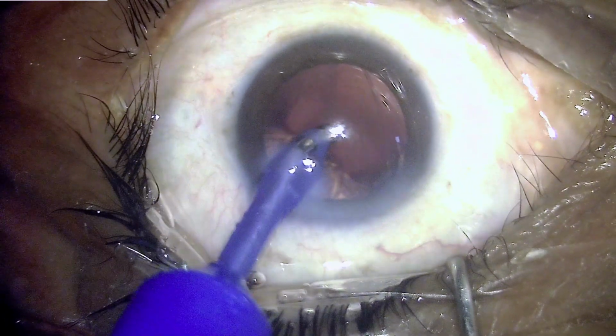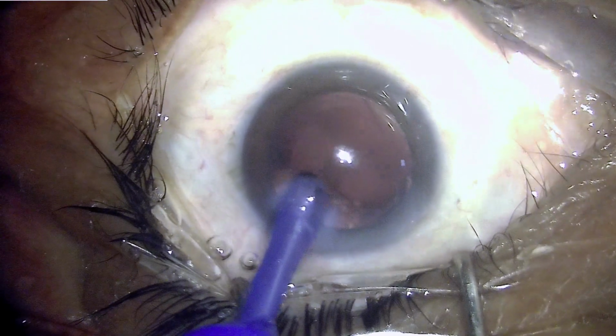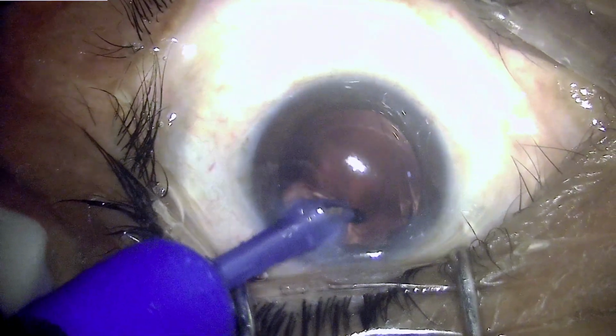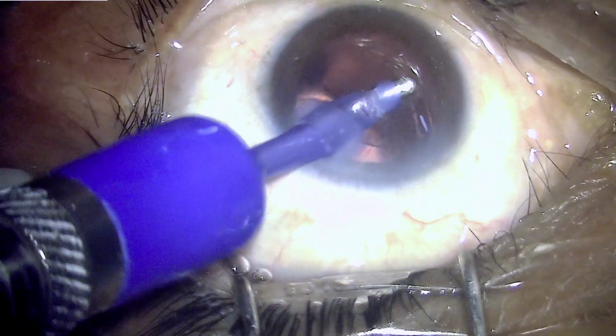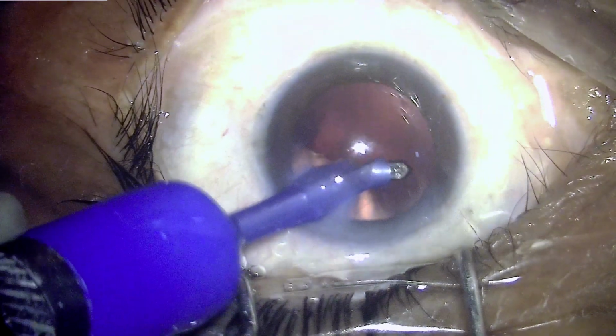So in a nutshell, one should keep the anterior chamber inflated and should not take chances like this. And I would even suggest that when you exit out and if you find that the anterior chamber may leak, we can use a swab stick just to occlude the lips so that the anterior chamber is maintained.